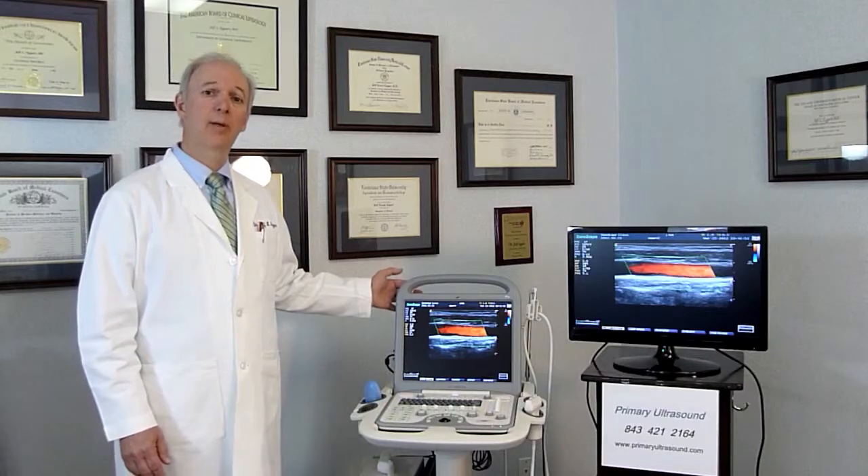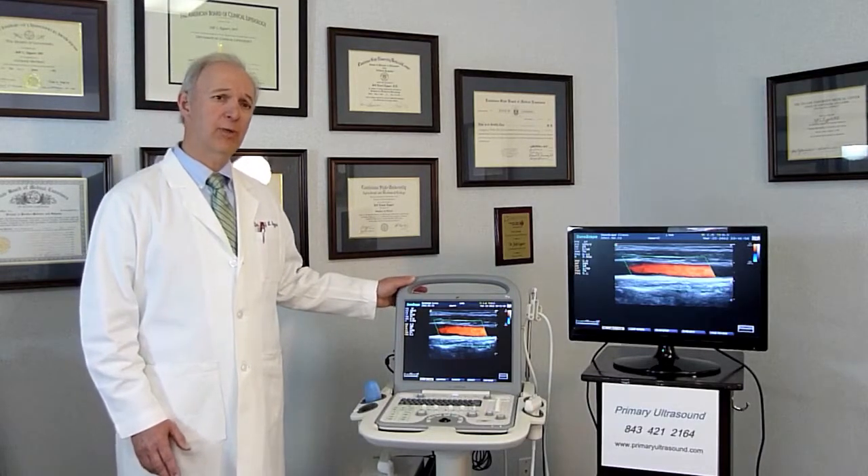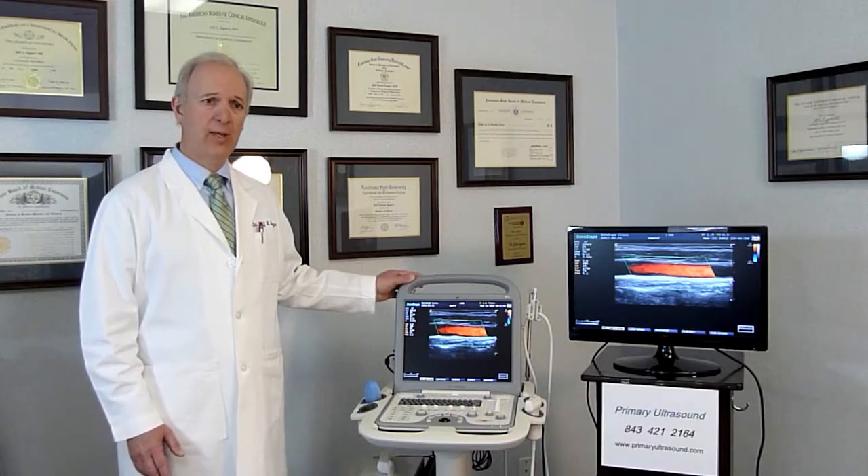Good morning. I'm Dr. Jeff Eggert with Primary Ultrasound, and this morning I wanted to review with you some of the features of the Sonoscape S8 Portable Compact Doppler Ultrasound. This is a remarkable ultrasound which has won awards for some of its technical advances.